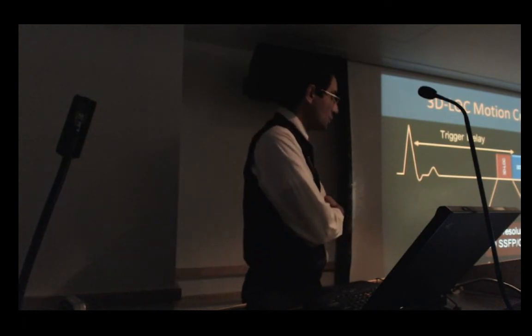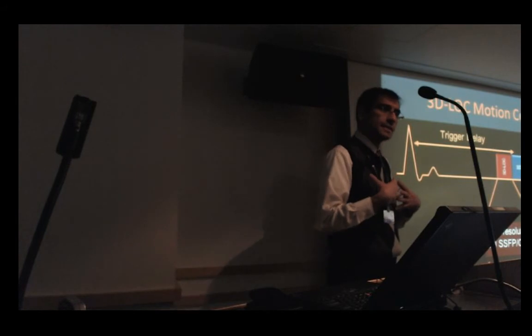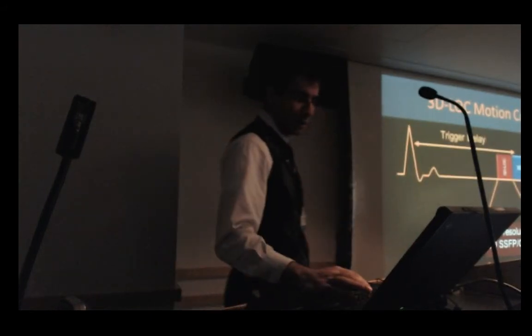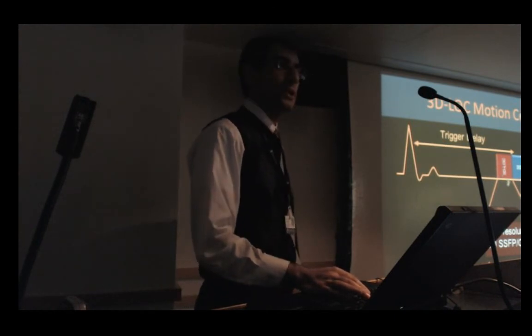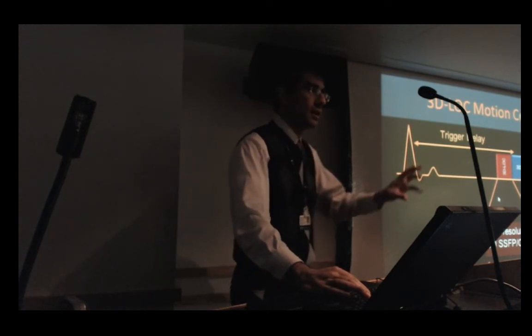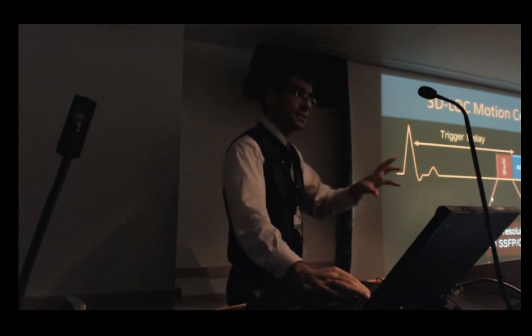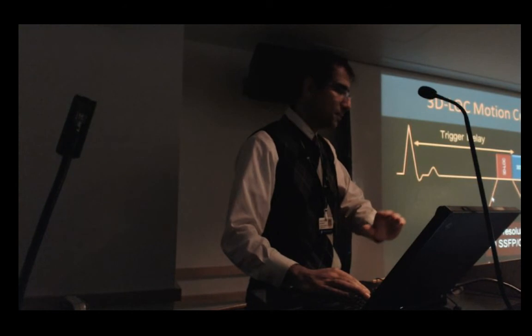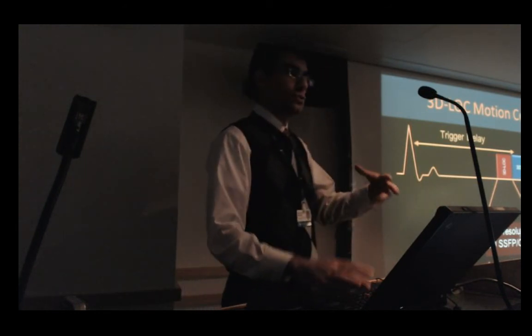So we can enhance this algorithm by increasing the number of parameters that we are estimating, extending to affine transformation or non-rigid transformation to account for the static region. To address that point from our fellow here, which was a very good question, we came up with another technique to suppress the static region of our field of view.